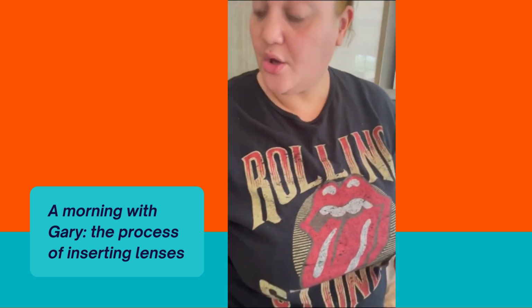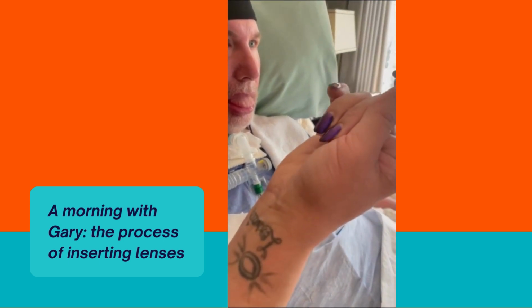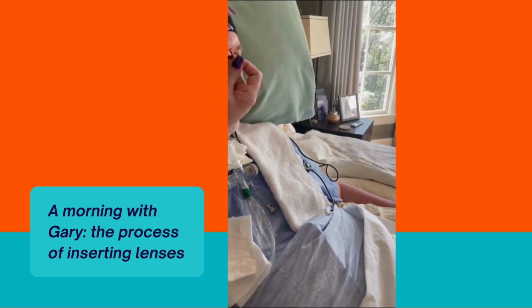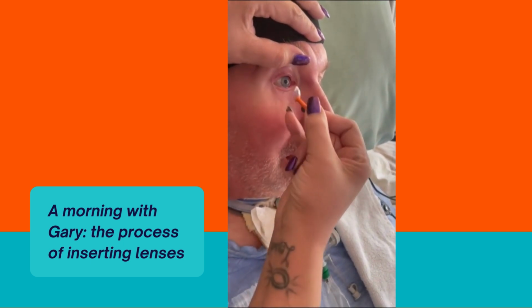So then you're going to go back over here, and you're going to get your orange tool. It might be green, it might be orange, and you're going to hold it between these 2 fingers. It just makes it easier. You're going to control the bottom with your pinky, and the top with your thumb. So we're going to lift the top of the eyelids with our thumb, the bottom with our pinky, directly under. And it comes right out just like this.